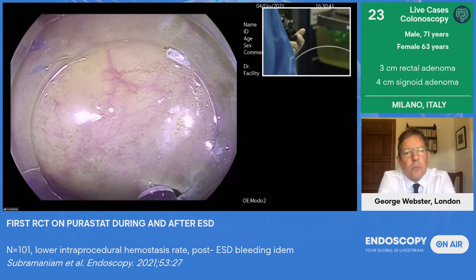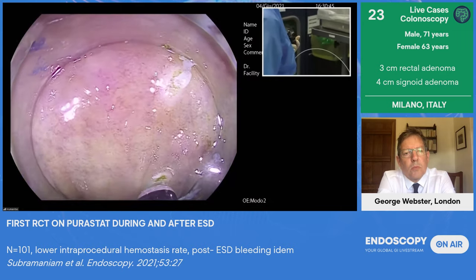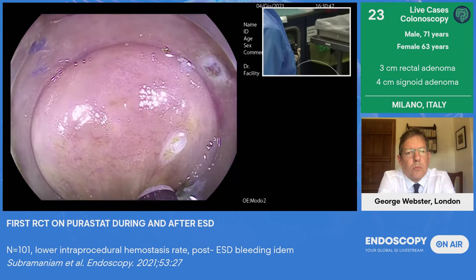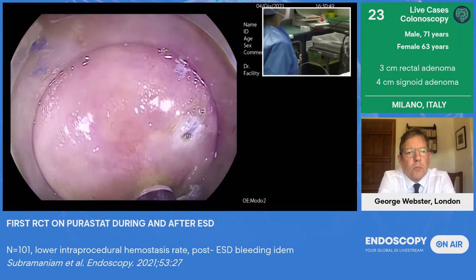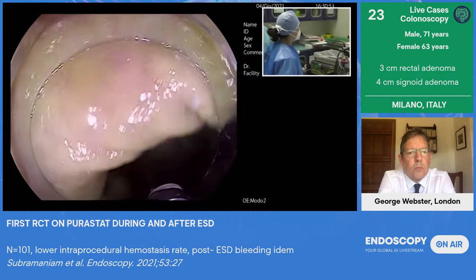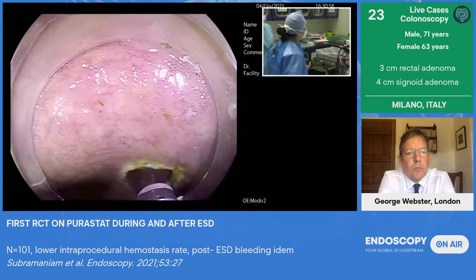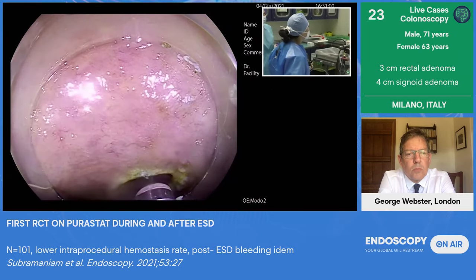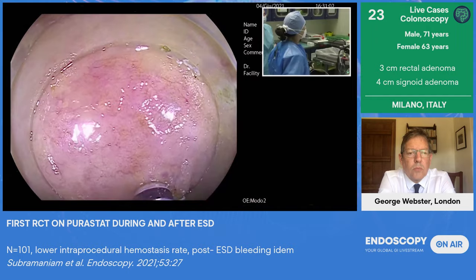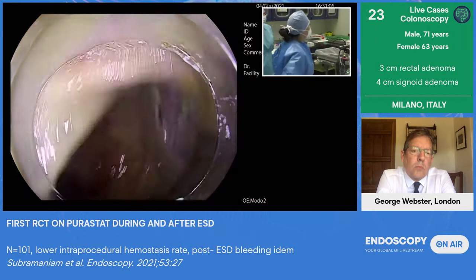So after making the circumferential incision, it's not enough to open the snare and catch it. Otherwise, it's possible that we won't be able to remove the lesion en bloc. So what I will do is to inject a little bit more to make the trimming. And then later on, I will open the snare and catch the lesion. Let me inject a little bit.